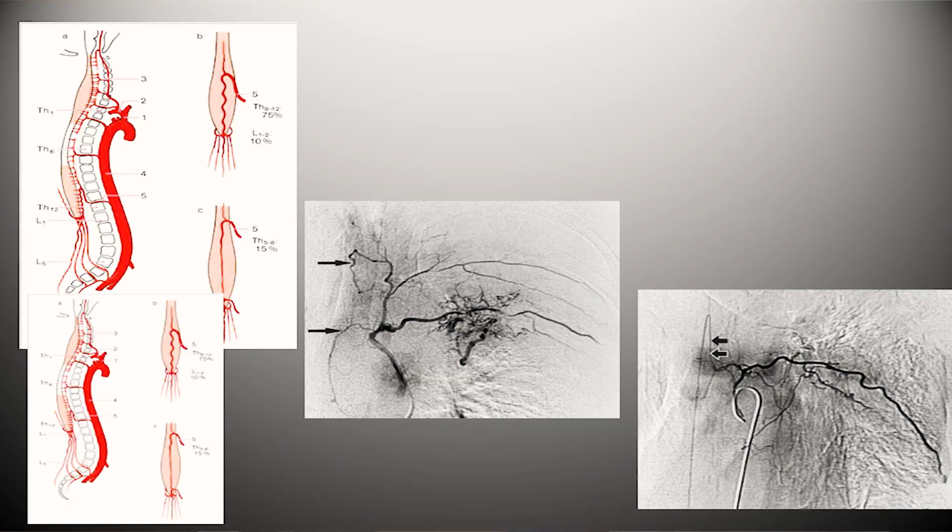But one thing which is dreaded and which leads to many medico-legal cases is spinal cord ischemia. Whenever you are doing bronchial artery embolization, in my department I have a separate clause added to the consent form that spinal cord ischemia can happen, without us doing any negligence or anything. We will talk about that. This incidence is 1.4 to 6.5%. So this is not trivial.